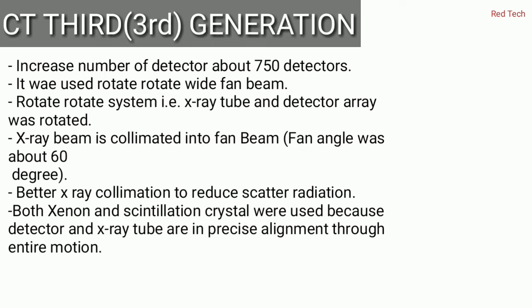Basically, we call it wide fan because the fan angle was about 60 degrees, as compared to the second generation, where the fan angle was about 10 degrees. In the third generation, the fan angle was about 60 degrees.